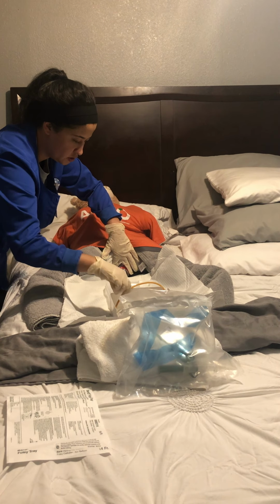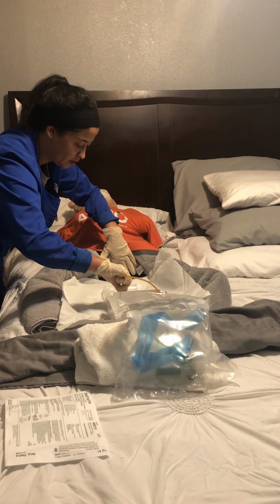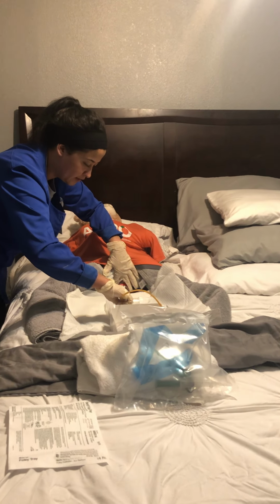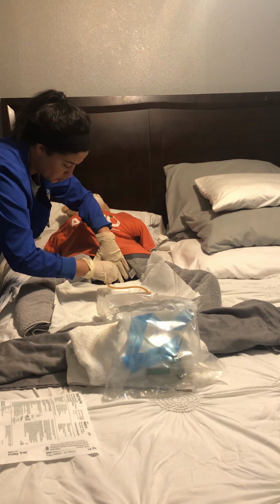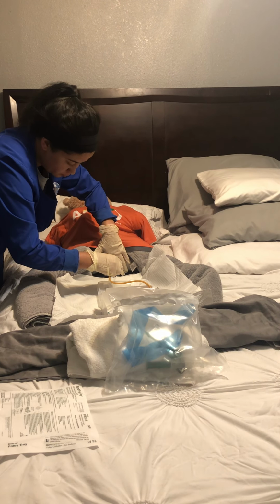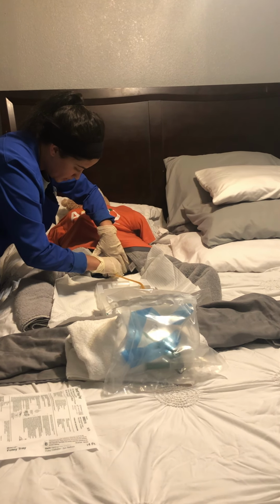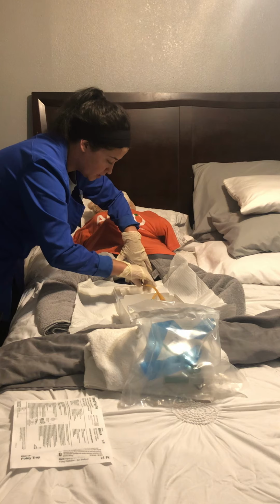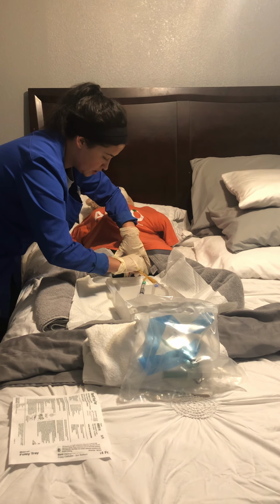I'm then going to get my catheter, put it in my lubricant, about 2 to 5 centimeters, depending on if it's a male or female. I'm going to place my hands pulling. I'm going to place the catheter in the meatus. Slowly walking my hand back. Once I see urine, I'm going to go about another inch in.